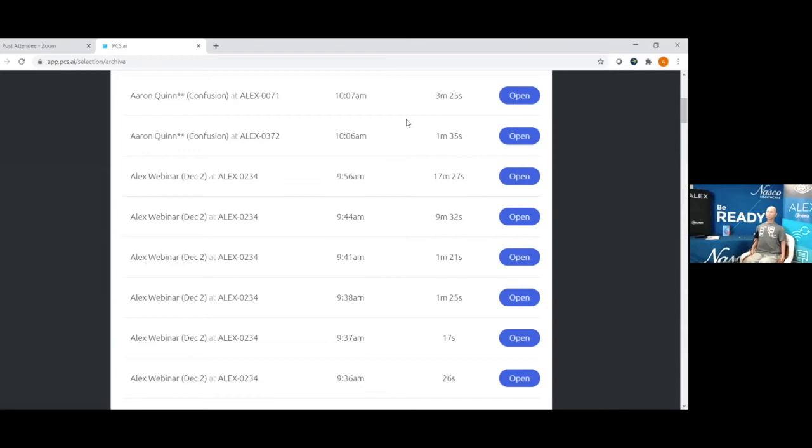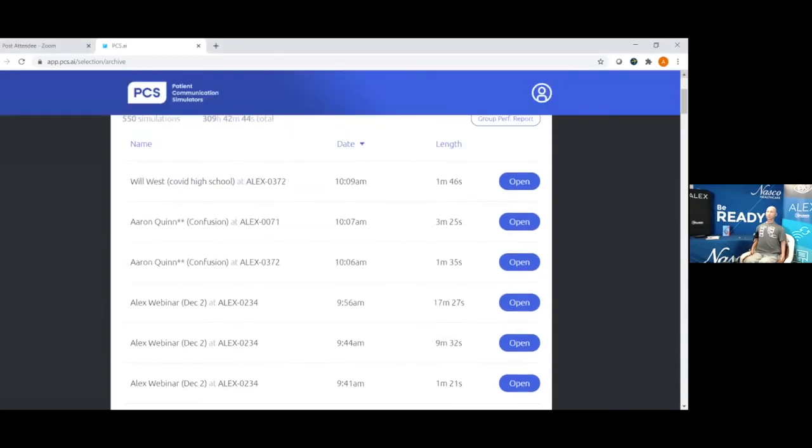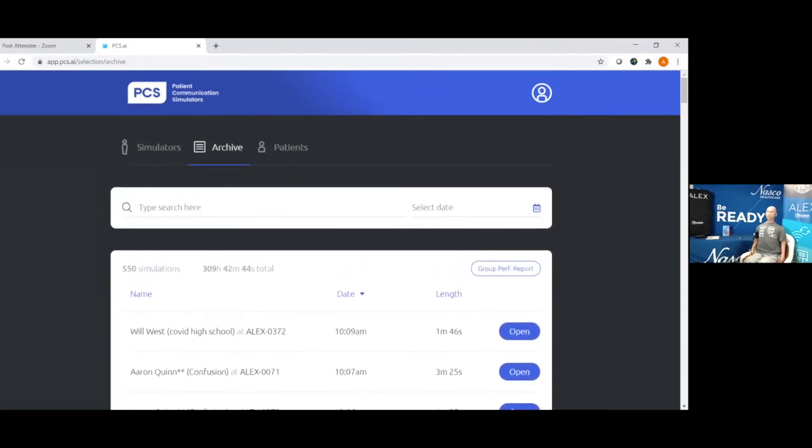I said, can we see when we touch the specific pulses? Yes, you can. It actually shows you in the specific location of where the pulse has been. So if it's the right radial or the brachial, dorsalis pedis, wherever you do the pulse, carotid, all of that comes up. Alex also has built-in CPR, and since he's not laying down, I did not get a chance to show anyone that. But he does allow you also to see the compressions and ventilations, depth and rate as well. Okay, so in the archive system, you'll be able to see there.